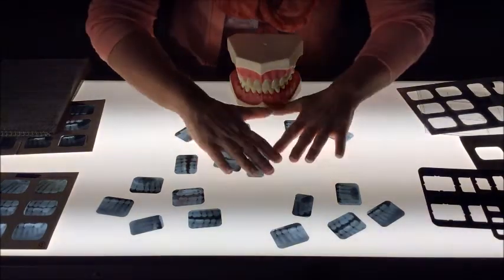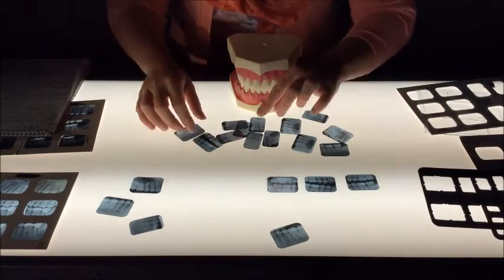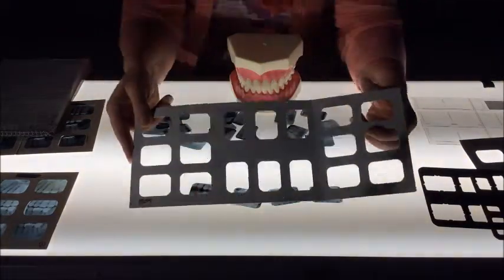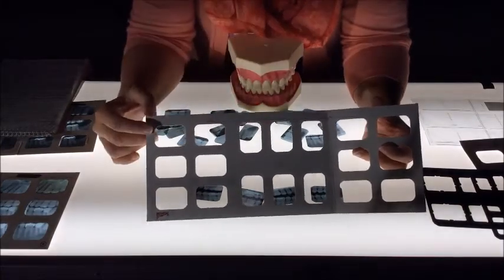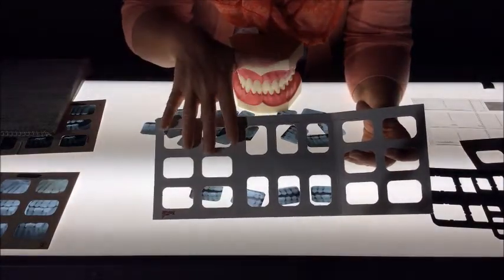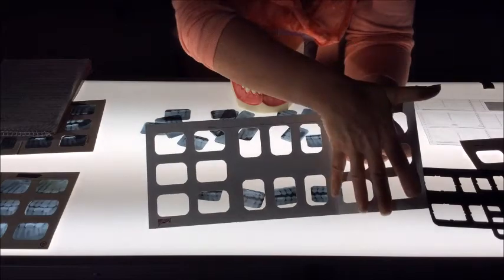The premolars are in front of the molars, and they're usually smaller. So when we look at all the films that are laid out here, just find first the ones that show crowns on the top and the bottom. And we have found those. There's 4 in this that show top and bottom. When we look at the film mount, you want to position it so that the labeling is facing you. If the identification dot is up, this side, whether top, middle, or bottom, is the patient's right side. Whether it's top, middle, or bottom, this is the patient's left side.